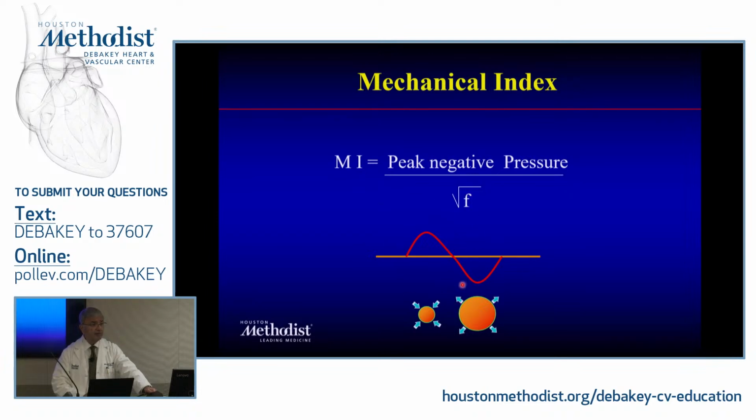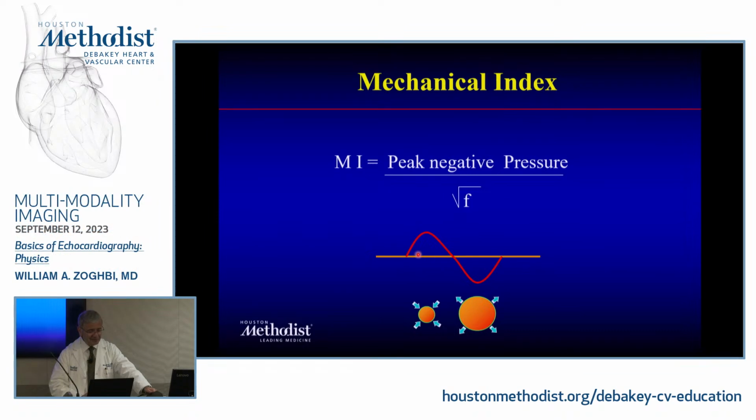And where it becomes very important is in the applications of contrast. Why? Because this is the energy that you're spending. Remember, this is the wave itself. So this is one of the megahertz waves, right? So this is one of the waves.